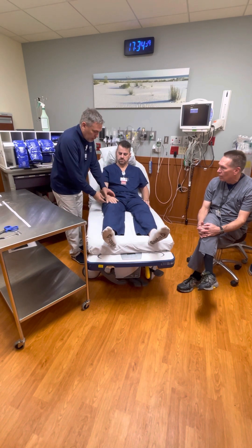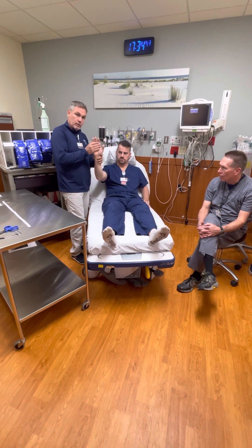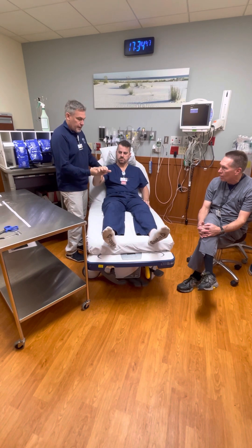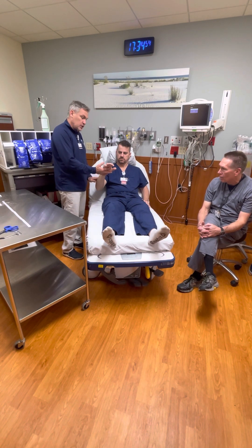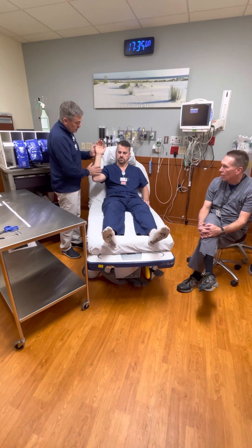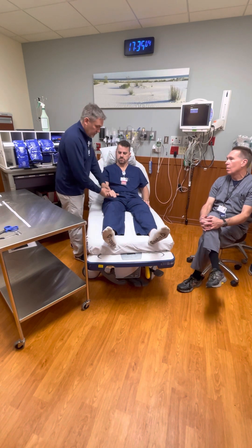We're going to talk about a modification of this volar splint in a neutral position by putting another layer of hardening material - splint material - on the dorsum of it just to protect the hand a little bit more. Sometimes providers will ask for an AP splint versus just a volar splint. AP stands for anterior-posterior.